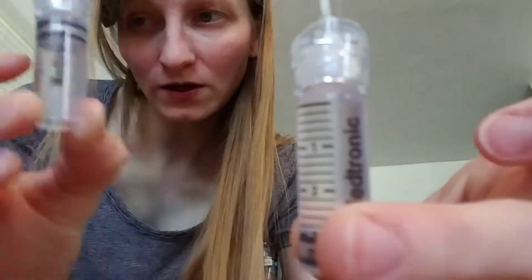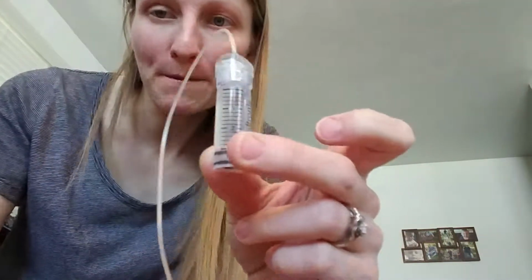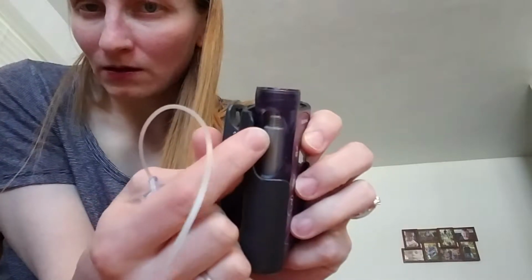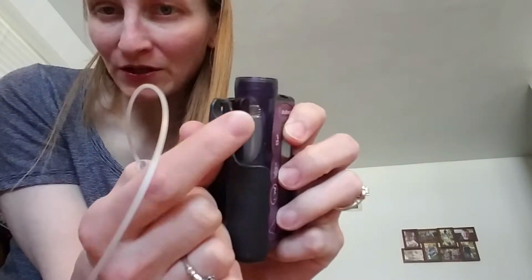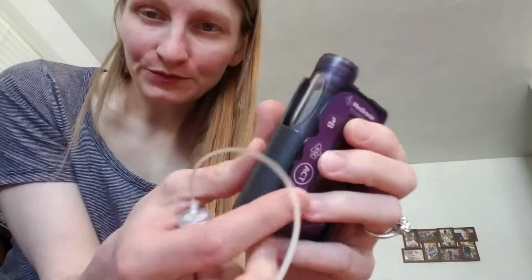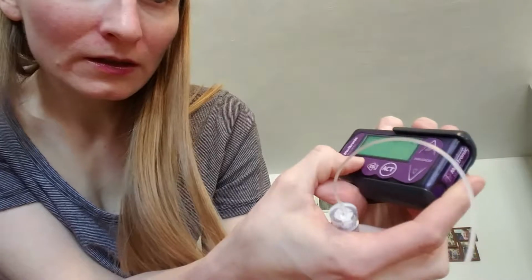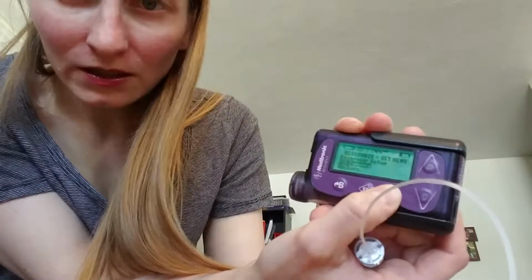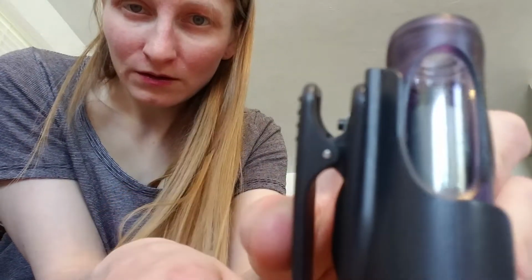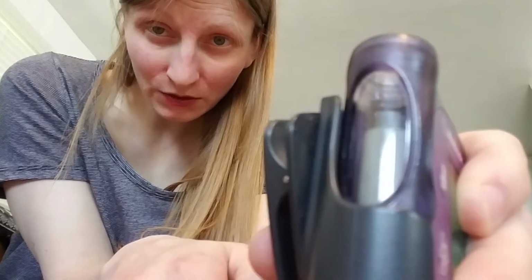It's up there now. It's all gone. Pretty close to gone anyway, like half a unit maybe left in it. Okay, now there is a pin, kind of screw thing, that slowly goes up as you use insulin. And so that's at the top right now because my last cartridge was almost gone. So I need to rewind it. So I have to get on my pump here and go to the reservoir setting and reservoir setup. And it's going to start winding it down. You can see it going.